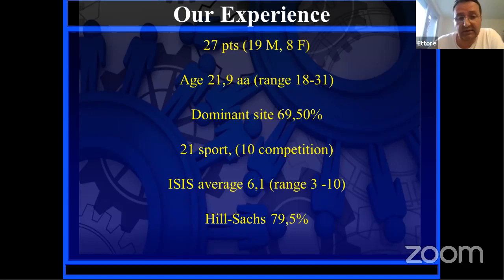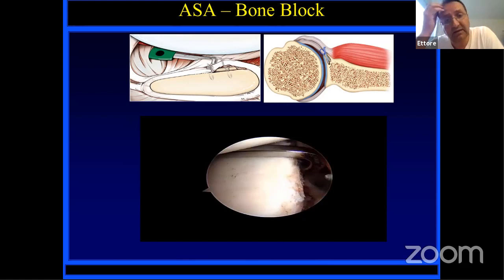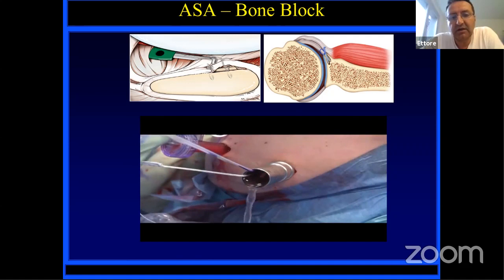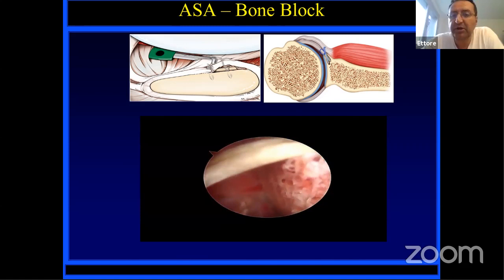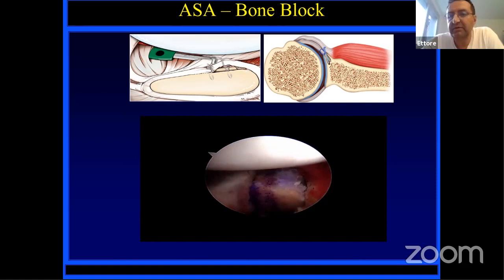And the last thing is something that I developed with two other Italian surgeons, Professor Russo and Dr. Maiotti. They wanted to do my bone block technique. This is actually the first case we did with Dr. Maiotti in Rome. I went down to help him. And as you can see, he's keeping the patient in a lateral position. So this is a technique, the bone block, that you can do without any problem in lateral and beach chair. Otherwise, for Latarjet, I would recommend using beach chair all the time.